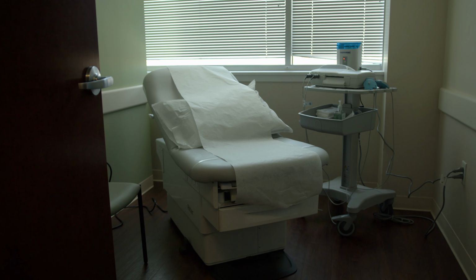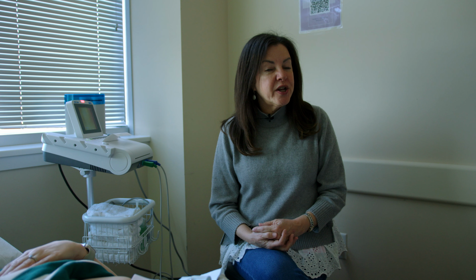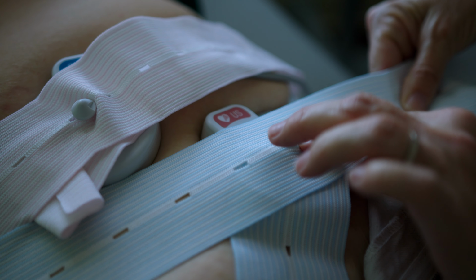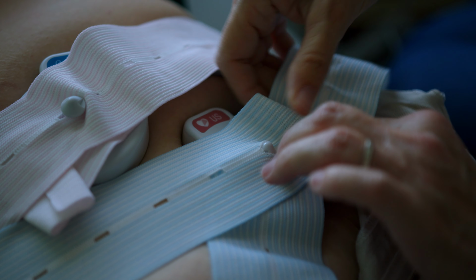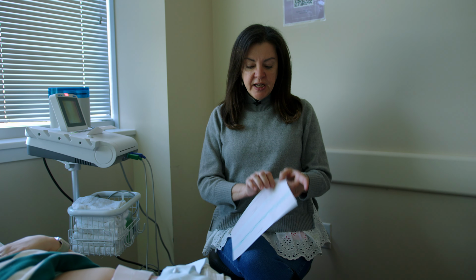I'm coming to you today from the non-stress test room in my office, and this is where we monitor babies' heartbeats and monitor you for contractions. So let's talk about how this test works and what it tells us. We do this test using 2 elastic belts that fit around your belly. One of them monitors the baby's heartbeat and the other monitors you for contractions. And we get a tracing that looks something like this.